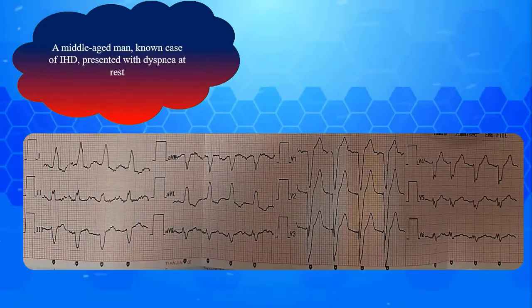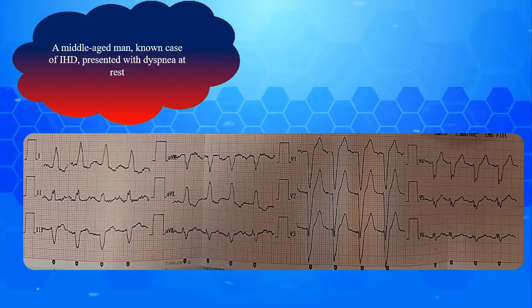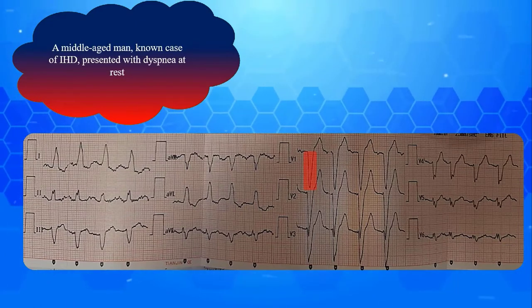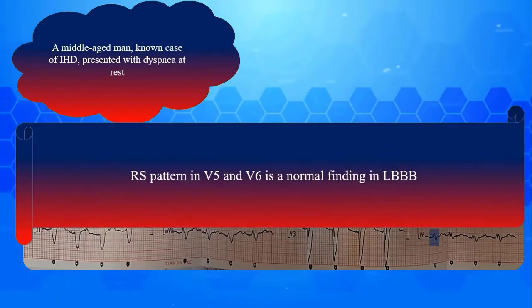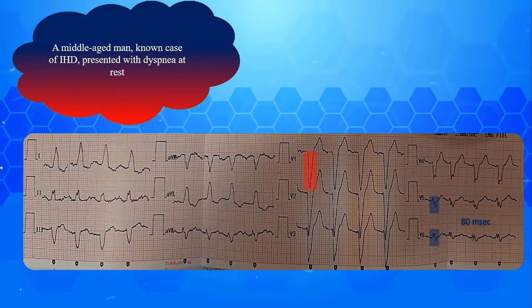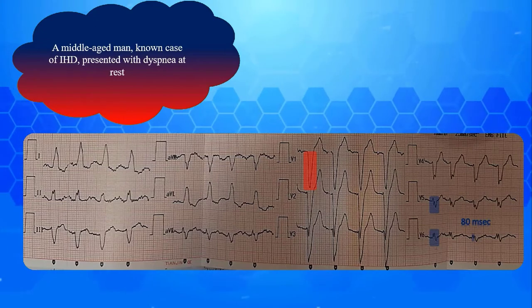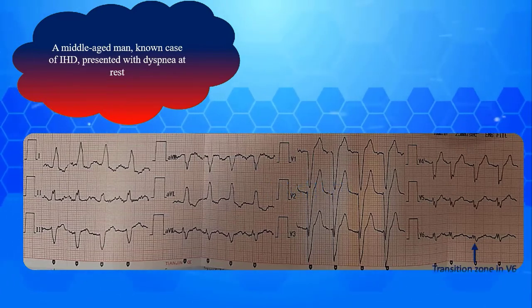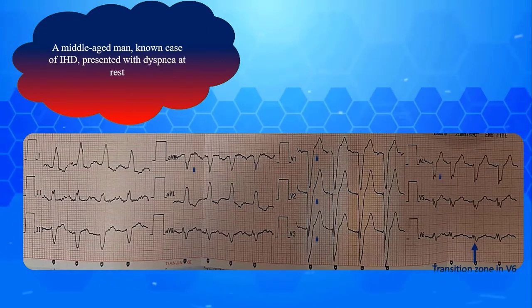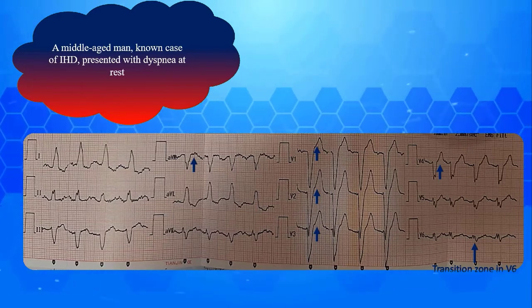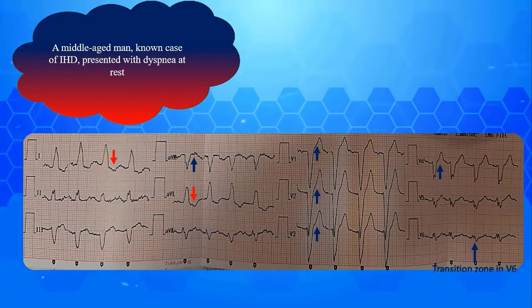The last example is a middle-aged man, known case of ischemic heart disease, presented with dyspnea at rest. The QRS complexes are clearly broad with deep S wave in V1 and RS pattern in V5 and V6 — recall that RS pattern in V5 and V6 is a normal finding in LBBB. No septal Q wave is observed in lateral leads. R peak time in lateral leads is obviously prolonged at about 80 milliseconds, confirming typical LBBB. Other associated findings are poor R wave progression and secondary STT wave changes. ST elevations with upright T waves in V1 to V4 and AVR are due to deep and broad S waves, while ST depressions and T wave inversions in D1 and AVL are due to dominant slurred R wave.